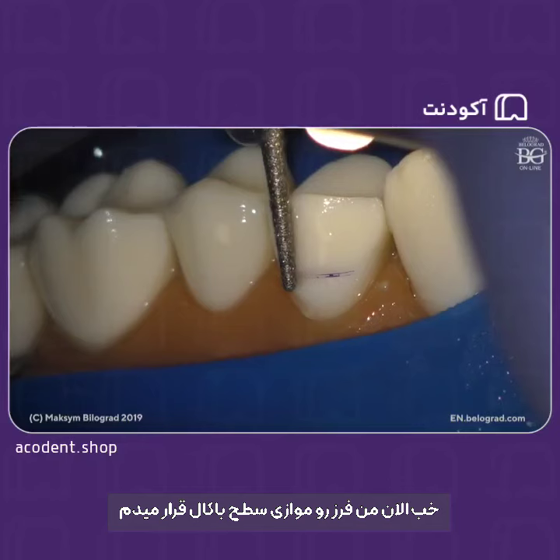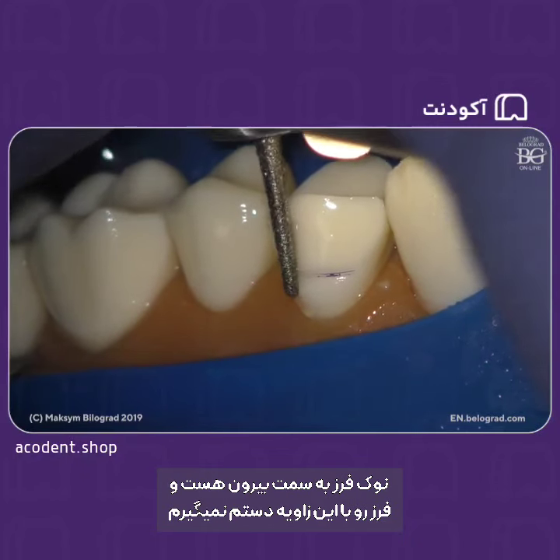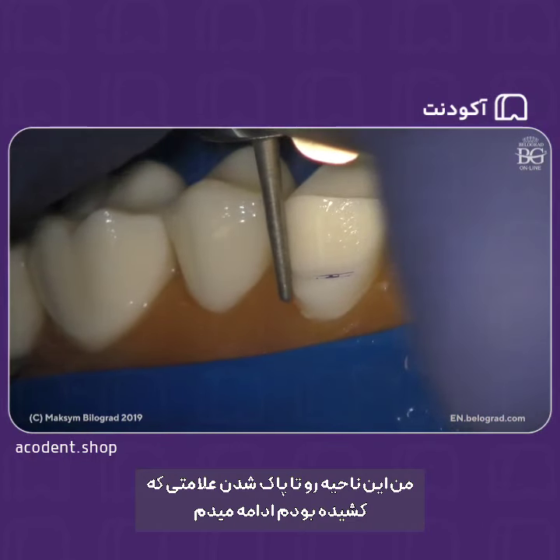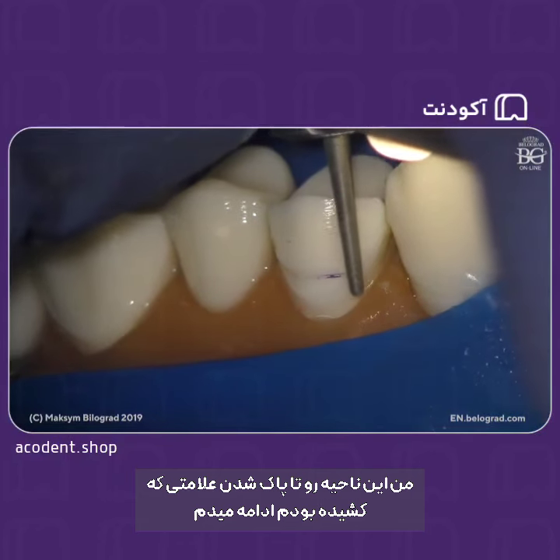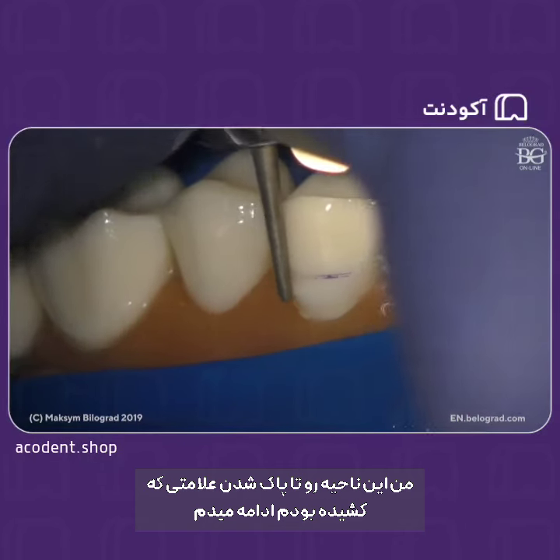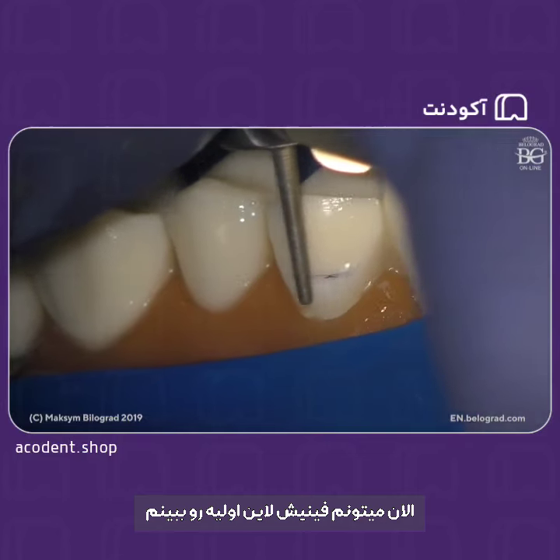So now I will put my burr parallel to the bulbosity. The tip of the burr is outside. I'm not doing this angle, just parallel to the bulbosity. And I will prep this area until I remove the groove, these marks, and I will be able to see the initial finish line.